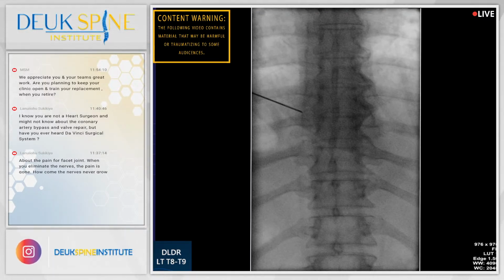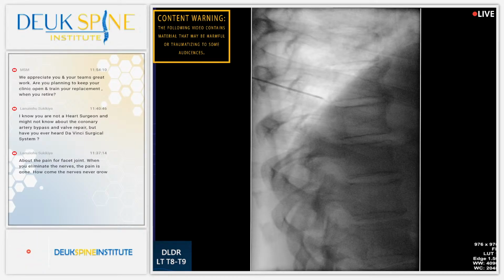Yeah. Way too lateral. Too lateral. I have to go more medial if I'm gonna want to get this shot.